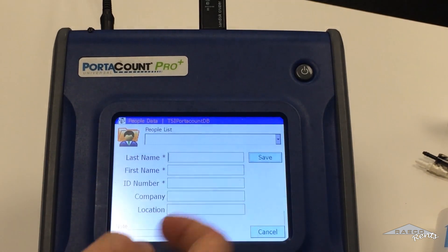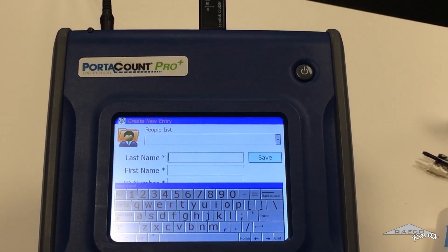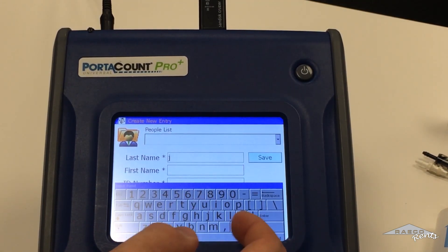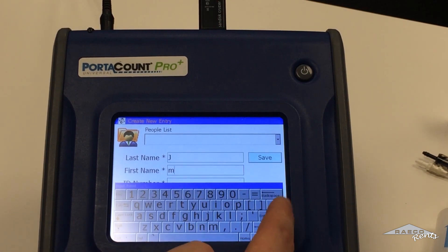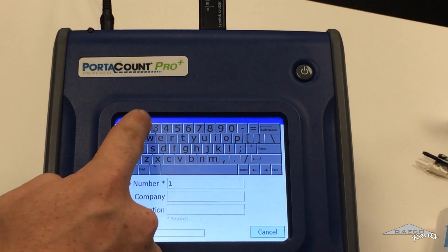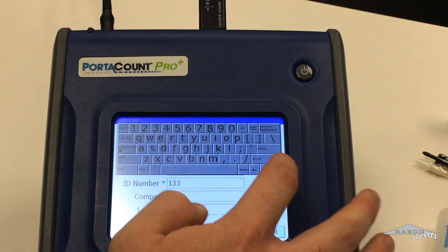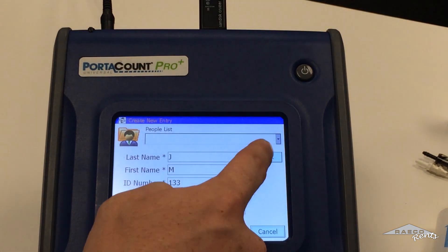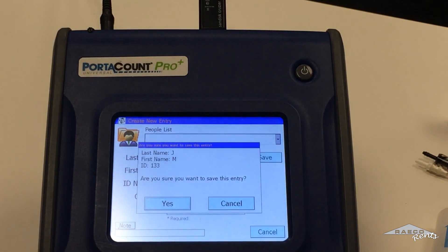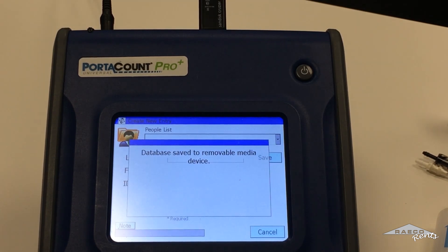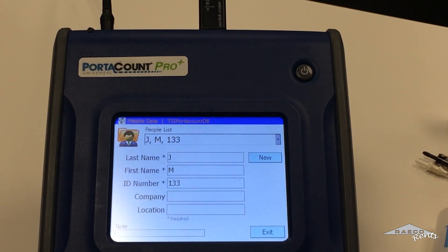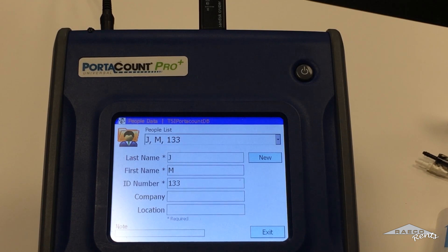So I've set this up already for myself. The way that you do it, just hit new, type in your info — I'll do it real quick here. Enter your ID number, hit enter, and then save. Hit yes to save, and that's going to save you to the database. You're going to want to repeat this process for every person that you're testing.